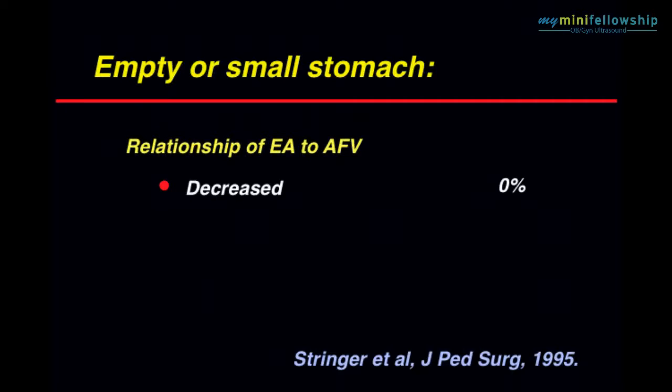Why am I so cautious? Because I realize that even with those findings, an empty stomach, or a dilated, empty or small stomach and polyhydramnios, I'm still not going to do all that well diagnostically. So we looked at the relationship of esophageal atresia to amniotic fluid.